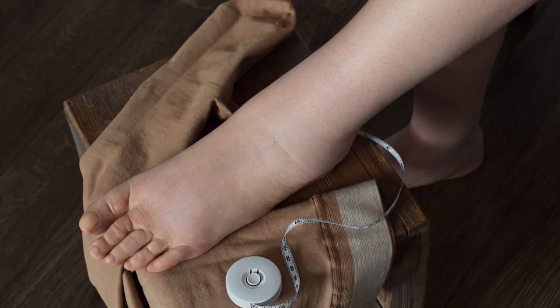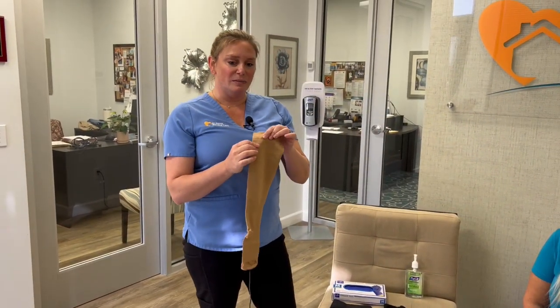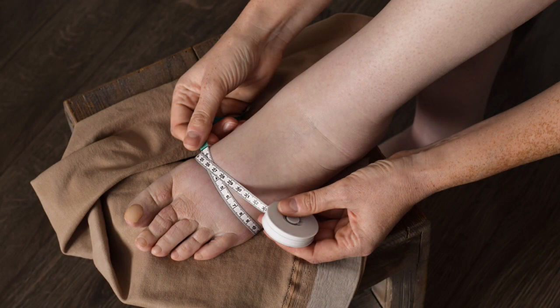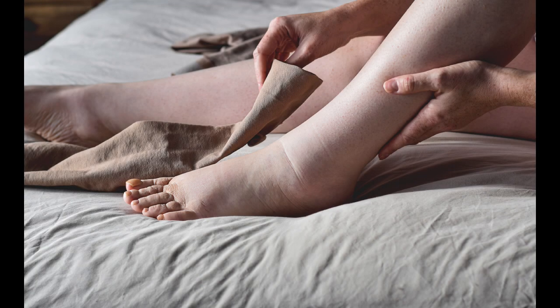Our compression socks will come in a variety of colors, and some have a closed toe while some are open toe. Some things to remember is that they are sized, so you want to follow the manufacturer's sizing guidelines. Some of the traditional ones require you to measure the circumference of your calf right below your knee, around the ankle, and around the foot — they are specially made just for that person and the size of their legs.